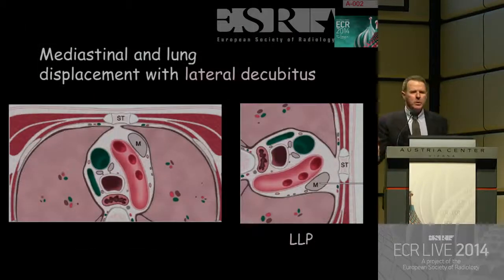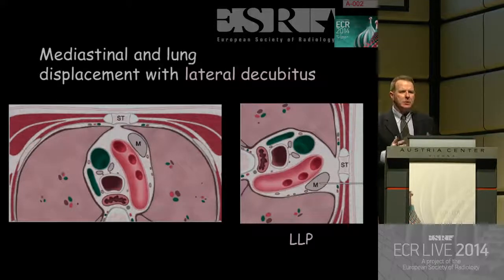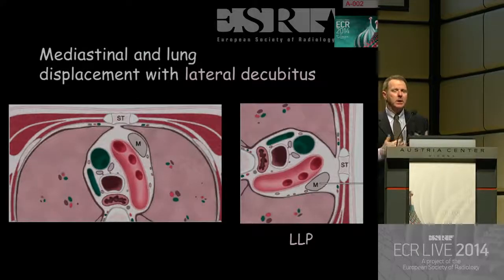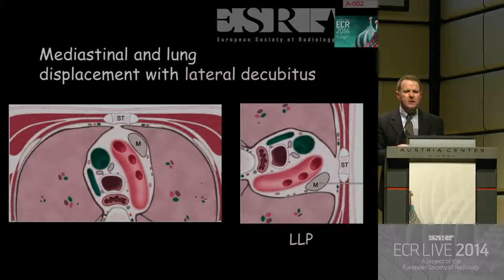As I said before, organs shift, bone moves, everything can be moved around, the patient, the needle and the target. One thing that you can do when you don't have a mediastinal window, like we have seen in those patients who had lung tumors close to the aorta, you may try to tilt the patient on one side or on the other side. And you may find out that the lung, where the patient is tilted, collapses a little bit, reduces the volume, and you may have a window that you didn't have before.